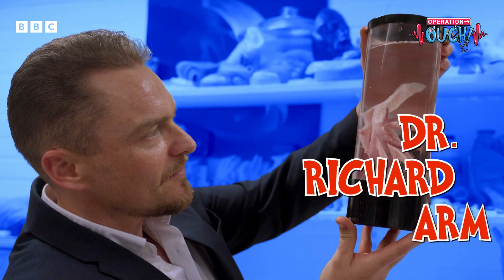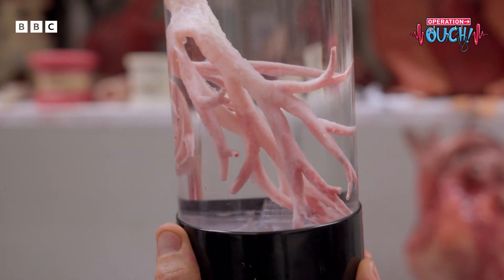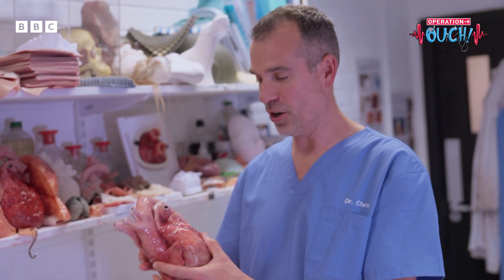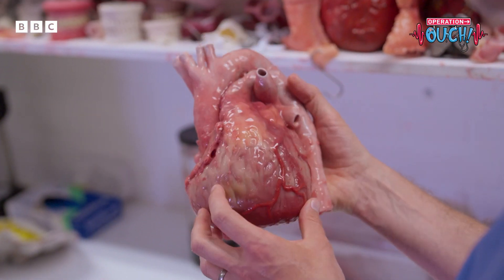Meet Dr. Richard Arm from Nottingham Trent University. He's the mastermind behind these super lifelike organ replicas. This heart, which looks incredibly realistic — how do you actually make this? We take x-ray slices through a living person.